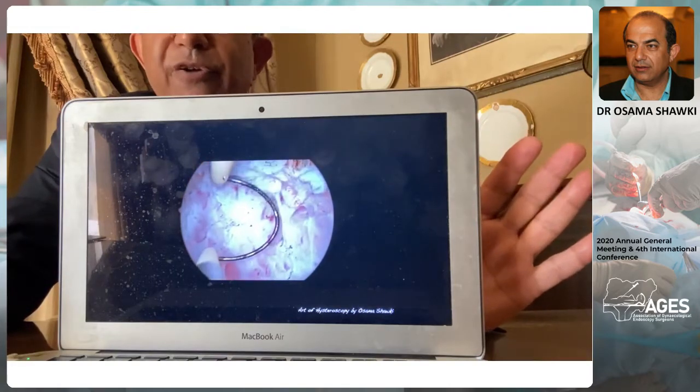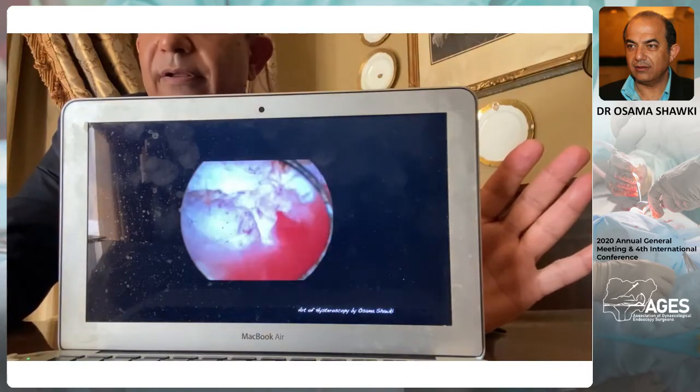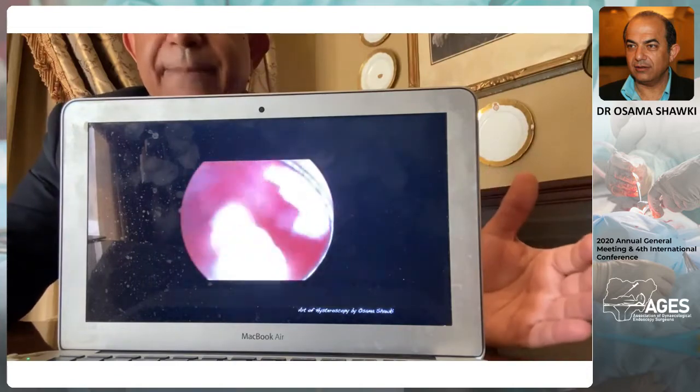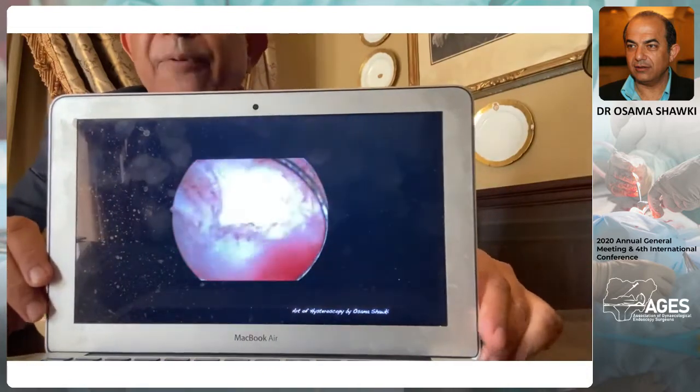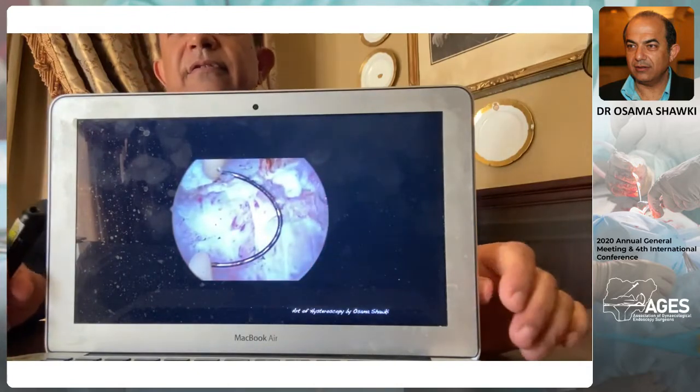That's a James Bond movie, all right? Let me show it to you again. This is the bleeder. Initially pressure is low. Increase the pressure gradually. This will tamponade the vessel and you see the source of bleeding. And touch.